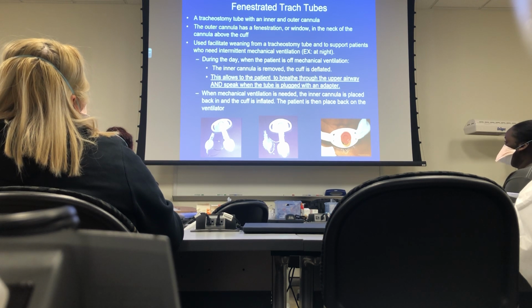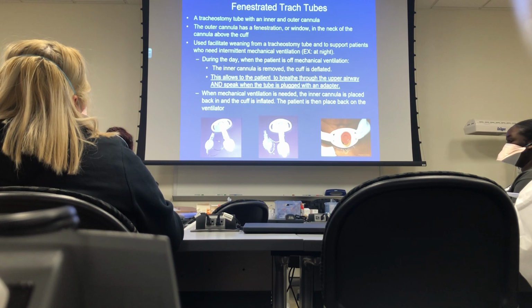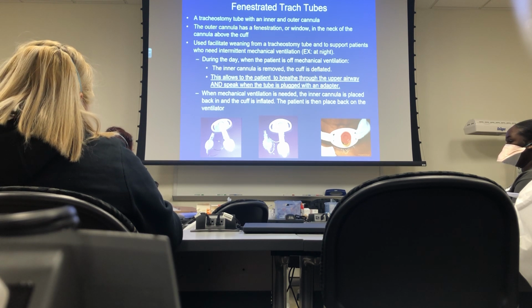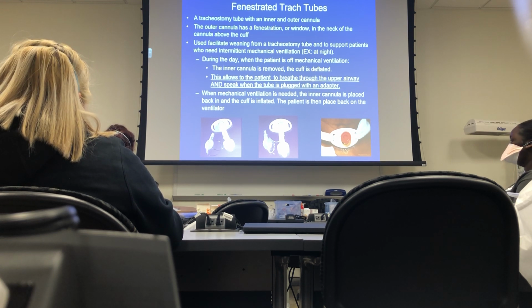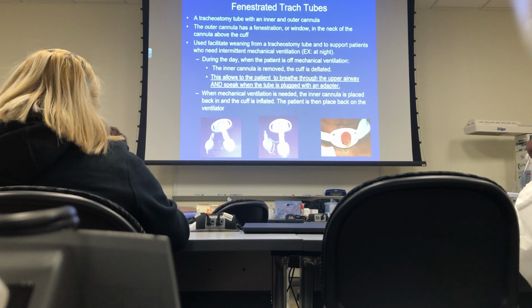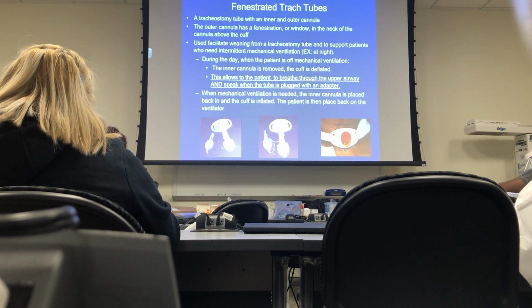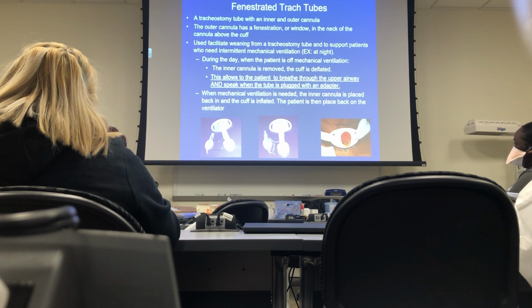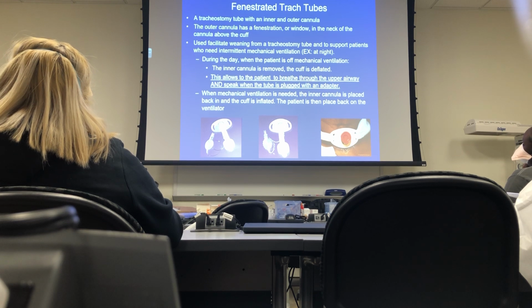It gets them used to using their upper airway, which they haven't used in a long time. Because with a trach, air goes in through the trach and out through the trach. When you button them, air goes in and out through the upper airway, okay? All right, if you don't button them, they'll use both upper and lower airway if the cuff is deflated. So, during the day when the patient's off mechanical ventilation, the inner cannula is removed, the cuff is deflated, and the red button is put on the trach, okay?